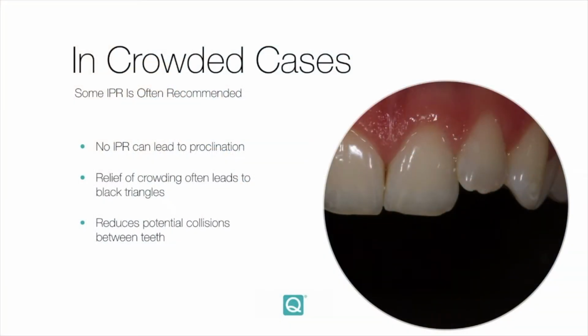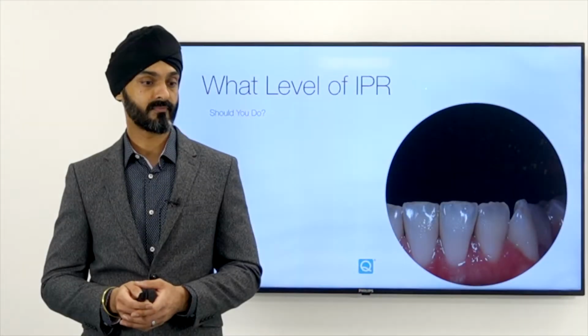So doing a mild amount of IPR at your review appointments will also free up the contact points, reducing collisions between teeth and ultimately ensuring your tooth movement is as smooth as possible.